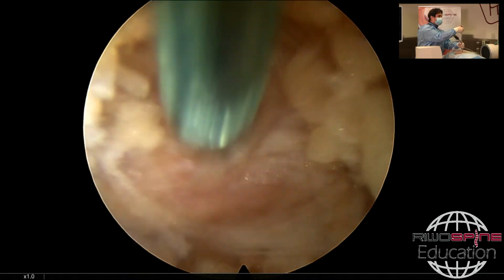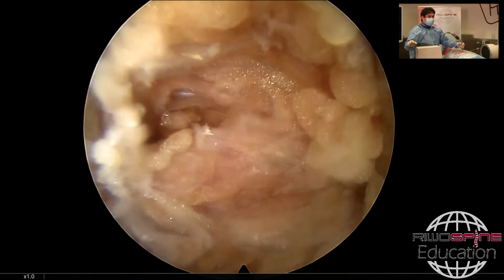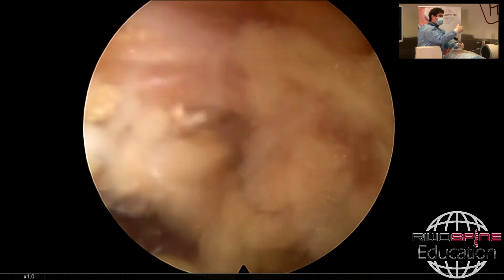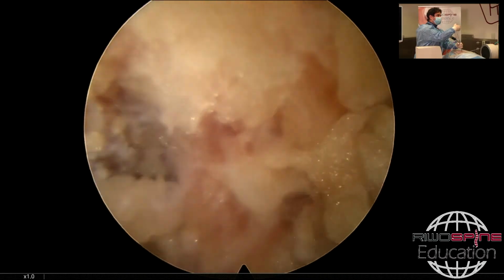Then you see the muscles again. At the same time, I also press the working sleeve down.